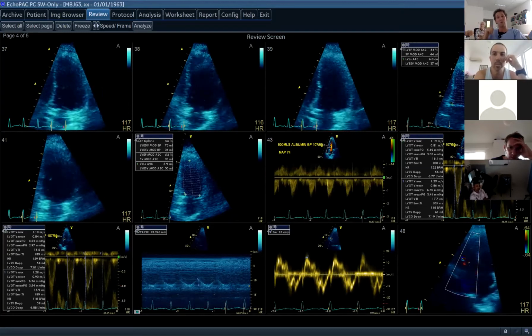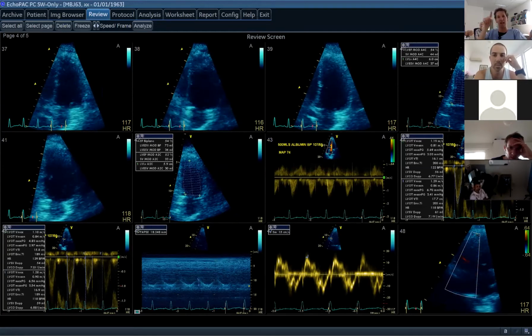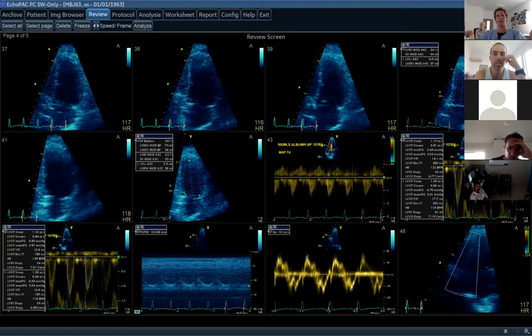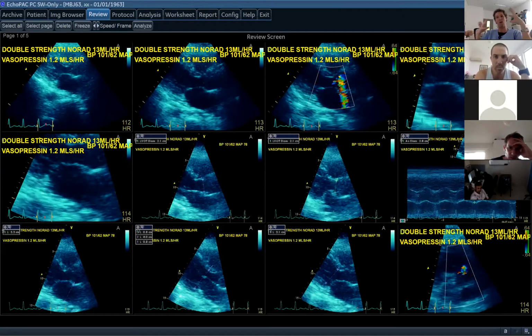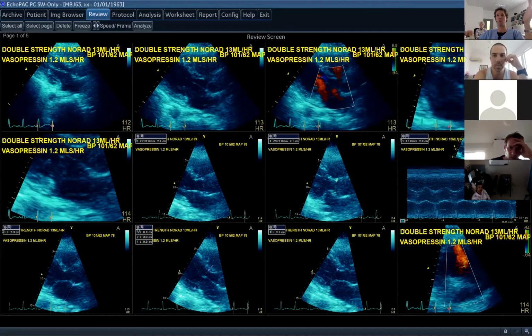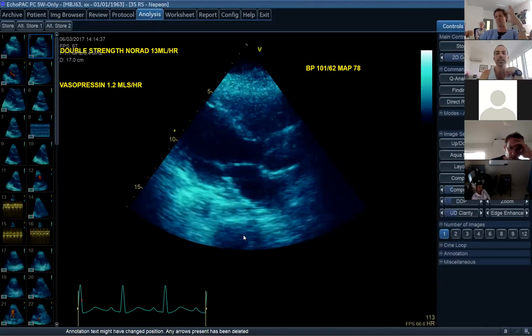So Louise quite rightly suggested that didn't look quite right. Maybe there's ischemia because that wall's not moving as well as the other one. My first thought is I'll go and check it out in other views to try and back that up. Yep. But reasonable thoughts. I thought it was a bit more global. Louise thinks there's some regional wall abnormality in there. I think probably she's got a fair point looking at it again. But let's say it's a bit more of a global picture.